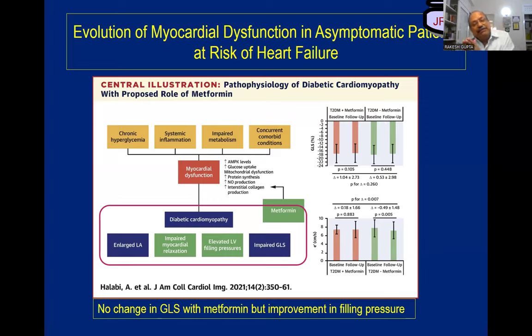If you look at an LA which is dilated, obviously this is normal in ischemic cardiomyopathy, dilated cardiomyopathies or valvular lesions. But if you see a dilated LA in the absence of any valvular or coronary disease, that is the most dangerous thing you are seeing in this population.